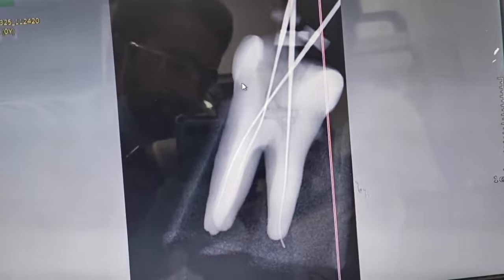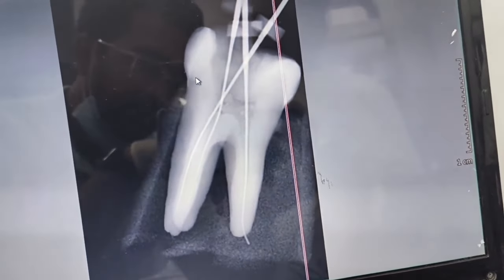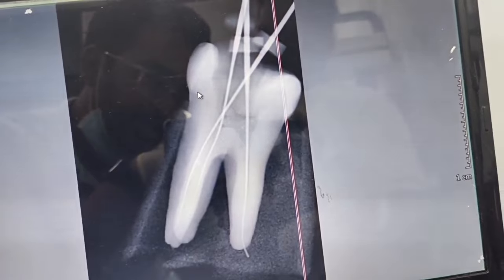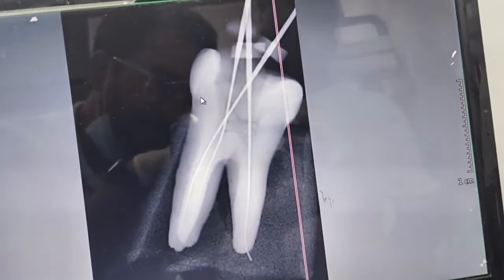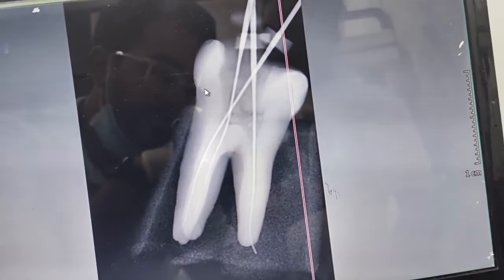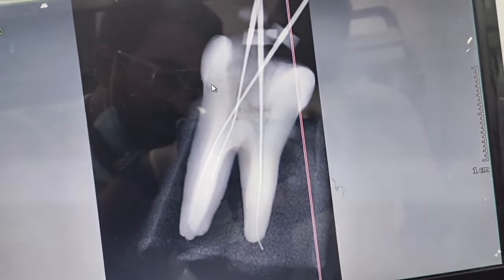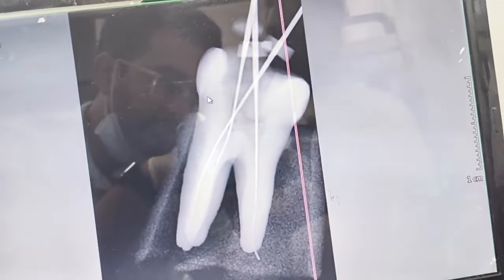And you can here scale, clearly see the mesobuccal canal and the mesolingual canal. And you can see it's a straight line path. File is coming from the opening area and directly it is going through a straight path. So we have to make a clear straight path with the hand files in order to use the rotary file system. So now we'll use number 8, we'll do K filing with number 10, then number 15, then number 20. Then after that, we'll be using the rotary endodontics.